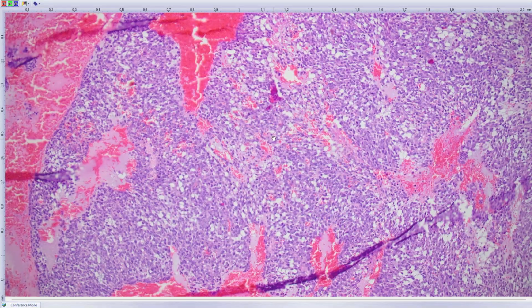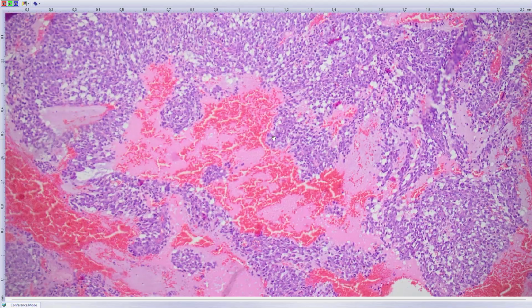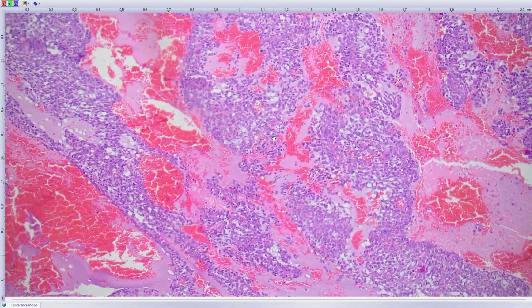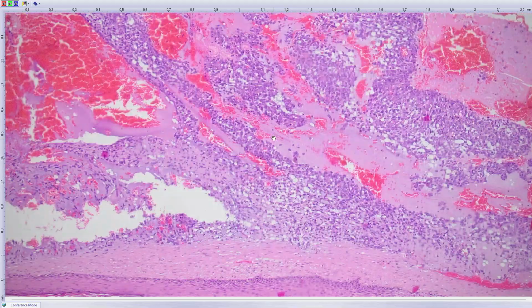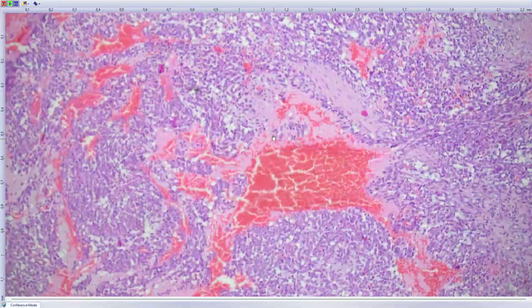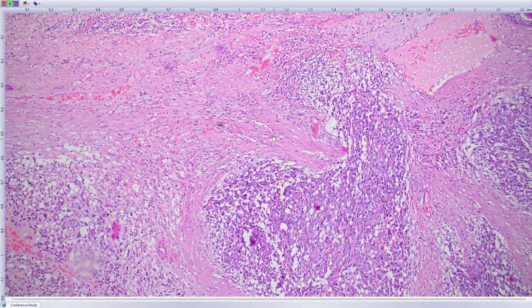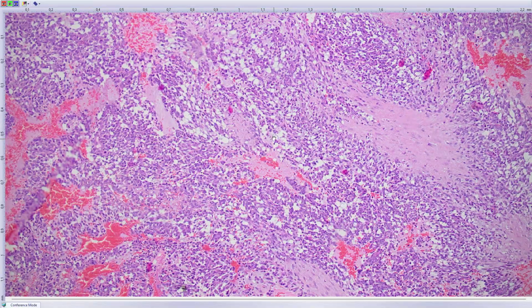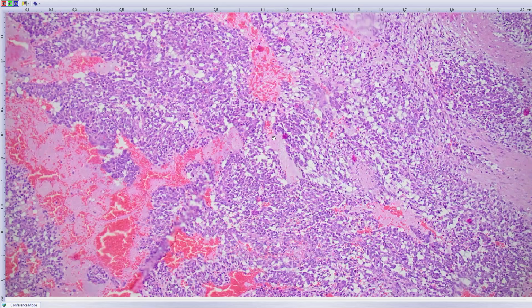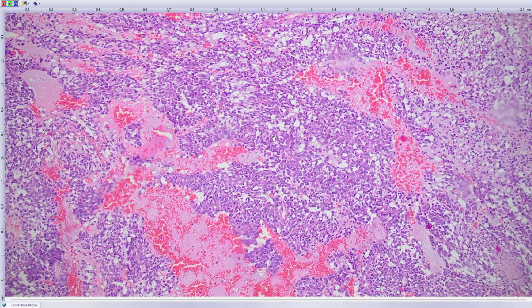So you can definitely think number one here should be to exclude melanoma, but all melanoma markers were negative. It can still be, of course, a dedifferentiated or undifferentiated melanoma, but that's basically already a molecular diagnosis in this case if you don't have any markers positive. They also did a broad spectrum of other markers. There was some CD99 membranous expression and WT1 nuclear expression.